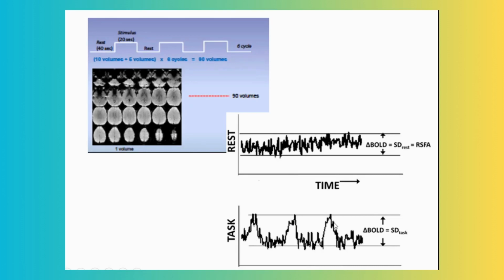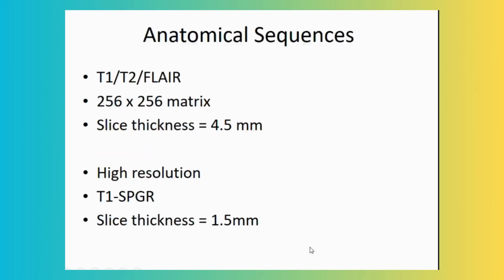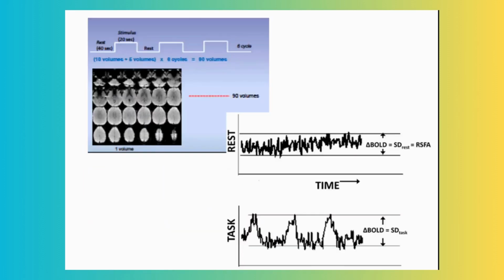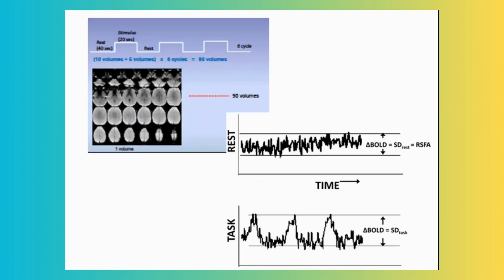So that's why the computer can combine all these signals into this signal. Enhance the signal. Yes, exactly. Because it's a very weak signal, like synaptic activity is very weak. And echoplanar imaging is helping us to acquire this data quickly after a certain amount of time.